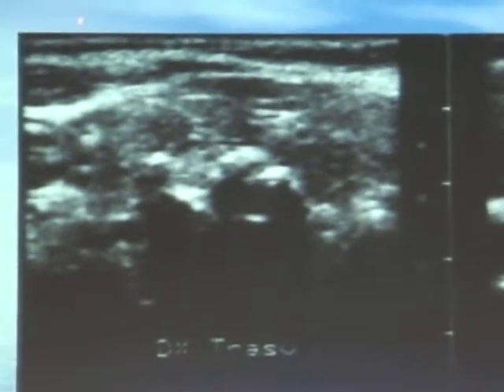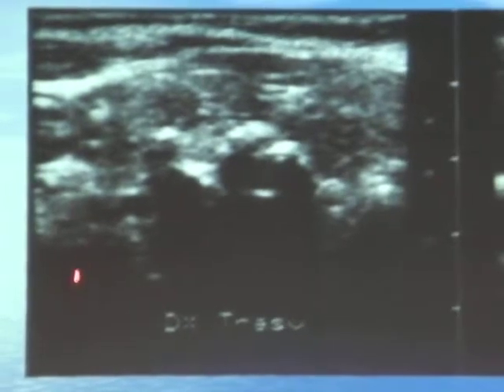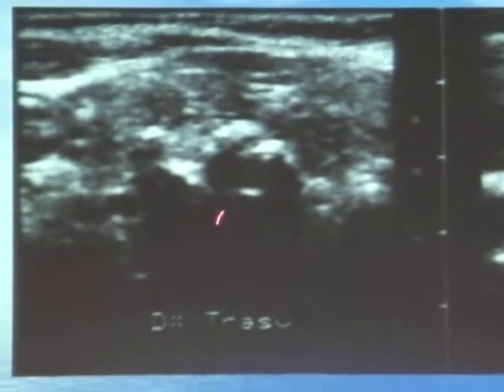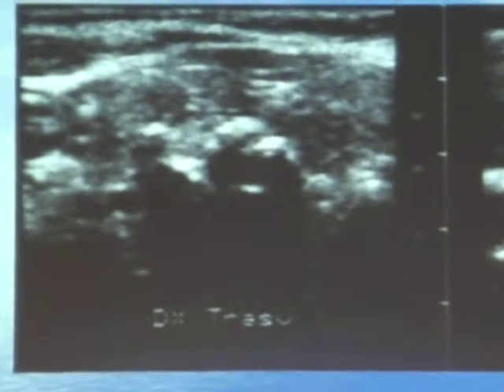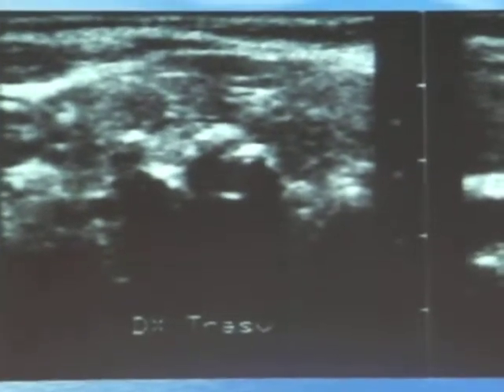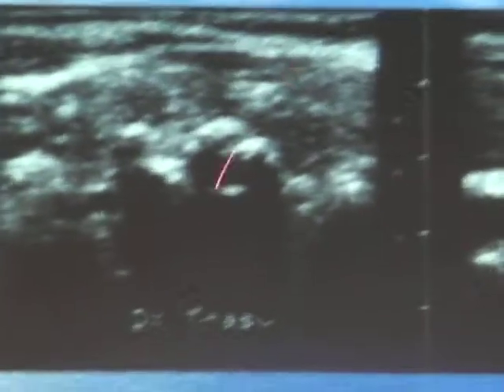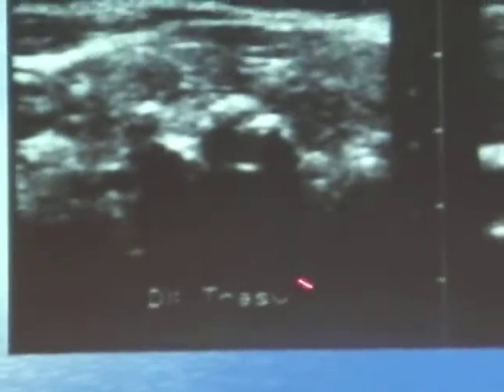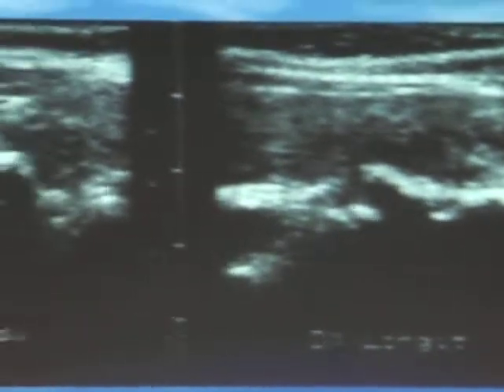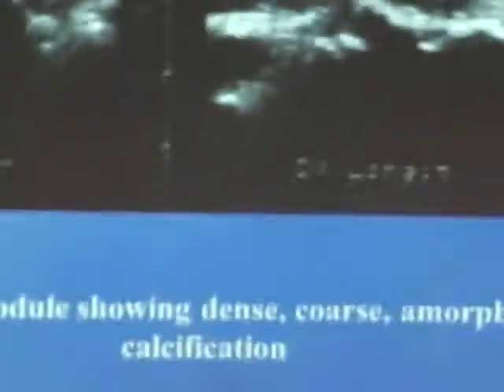On the other hand, if you see here, you can see an image right through. That's because the ultrasound beam has traveled further, but here it can't. So wherever in the body, whether it's gallstones, whether it's kidney stones, whether it's calcification, the thyroid, wherever it may be, you will get this similar picture. This is calcification, and that is the posterior acoustic shadowing that you get, which simply means that there is no ultrasound information behind here. It doesn't mean that there's nothing there. Yeah, the nodule is definitely there, but you just can't see it.